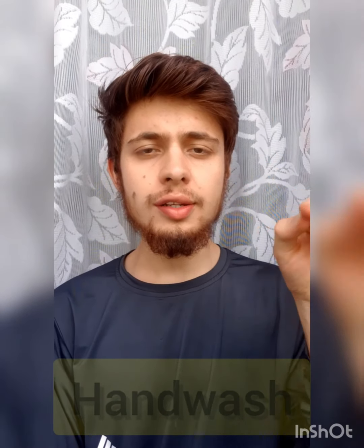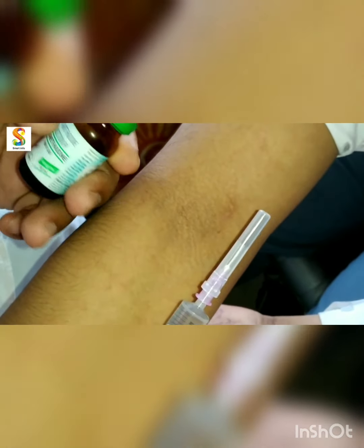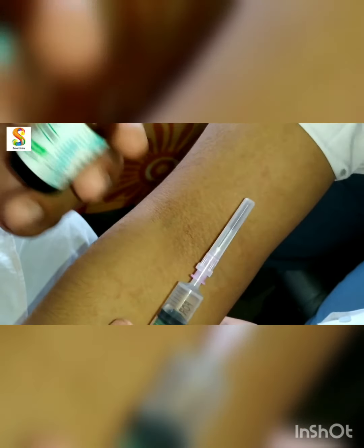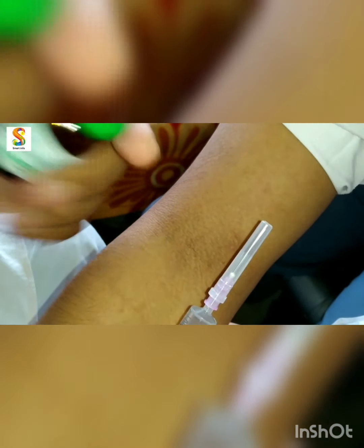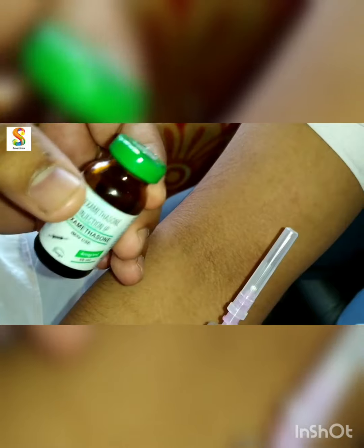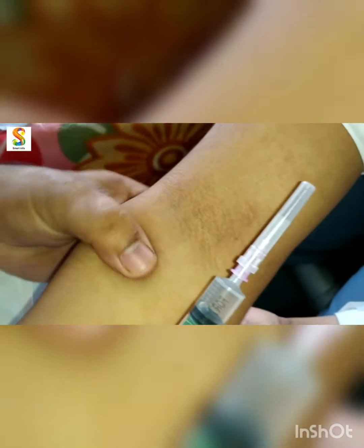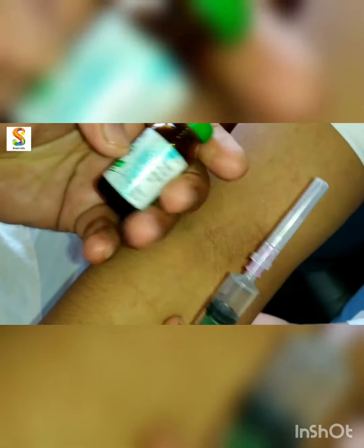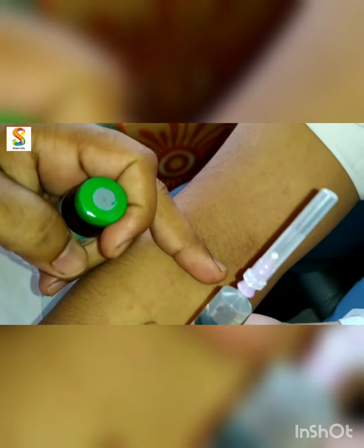So now let us have a look at the algorithm of how it is actually done. You can see there is a site which we have selected for the purpose of injection. We need a syringe, and here we are using a drug known as dexamethasone. As I will show you on the camera, I will zoom in, it's dexamethasone. Here we will use this drug to incorporate into the prominent vein of a person. I've already filled the injection into the syringe.